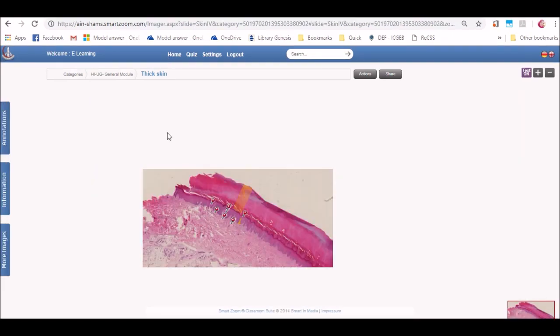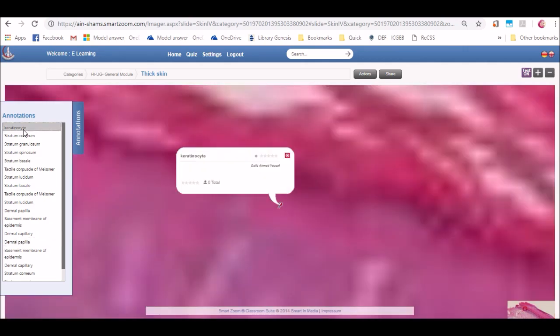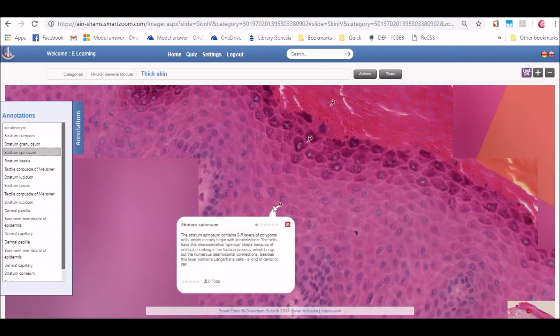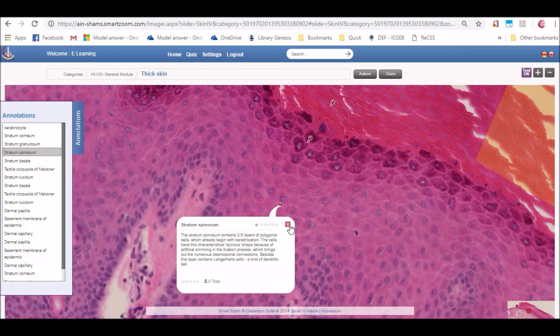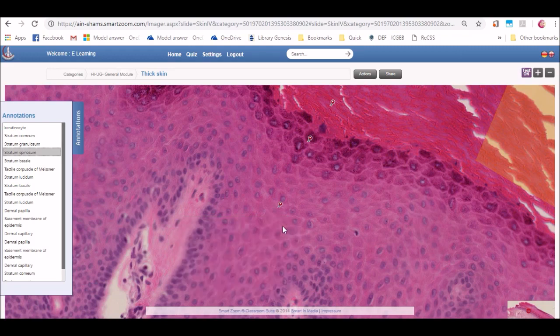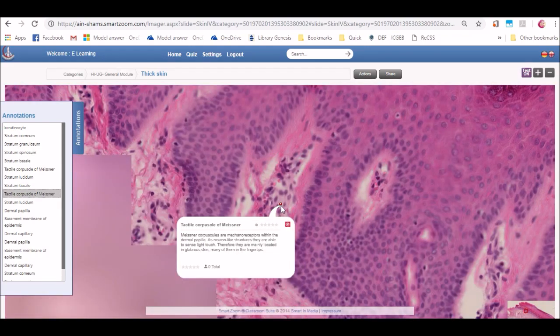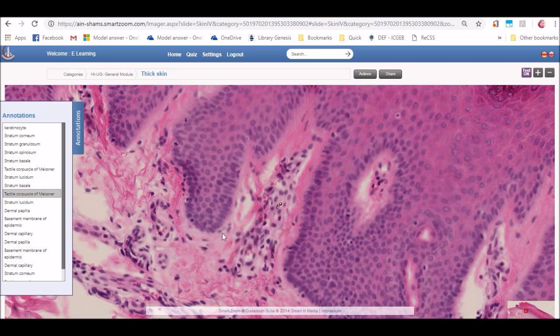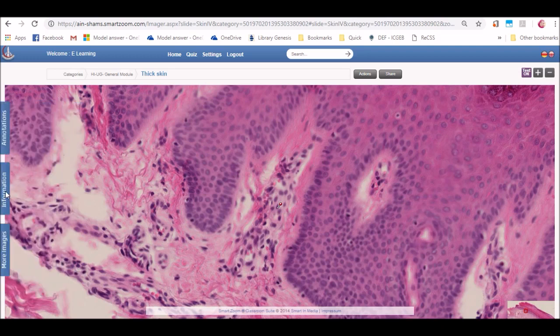On the left, you will find three boxes. The first one is for annotations. It is a list of all the annotations listed on the slide. By clicking on any of them, it will direct you to the annotation on its proper magnification. The second one is for information and the third one is for more images from the same category.